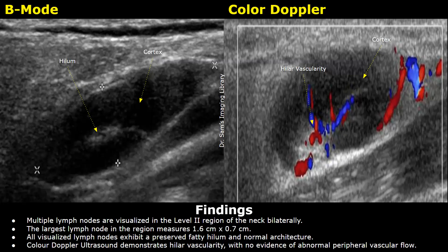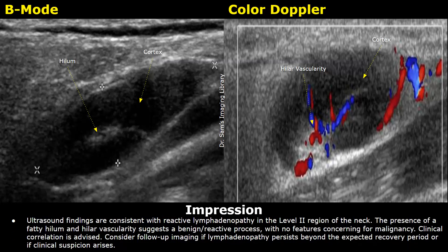Color Doppler ultrasound demonstrates hilar vascularity with no evidence of abnormal peripheral vascular flow. The impression: ultrasound findings are consistent with reactive lymphadenopathy in the level 2 region of the neck. The presence of a fatty hilum and hilar vascularity suggests a benign or reactive process with no features concerning for malignancy. Clinical correlation is advised; consider follow-up imaging if lymphadenopathy persists beyond the expected recovery period or if clinical suspicion arises.